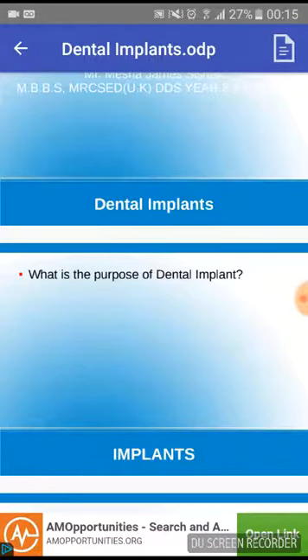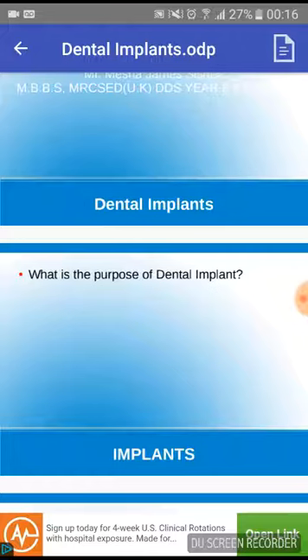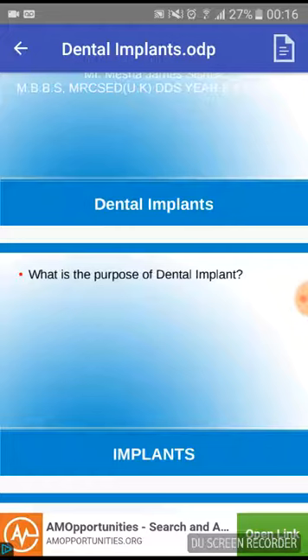It must be stiff, and stiffness refers here to the resistance of a material to break under force. So, for instance, the material cannot bend easily when it's placed within the alveolar bone. Okay? It must also have good tensile strength. So, in other words, when you want to pull something to the point that it's breaking, the material must not break. Put it that way. It must be able to form like fine wire. So that's tensile strength.